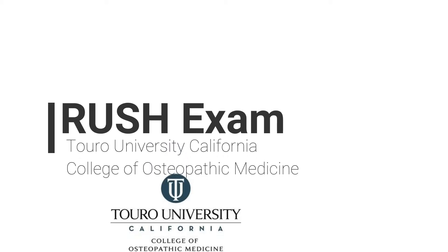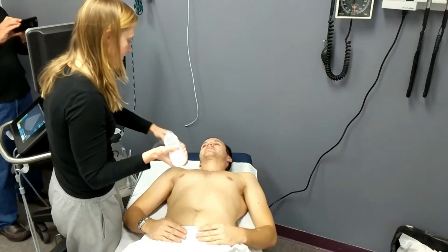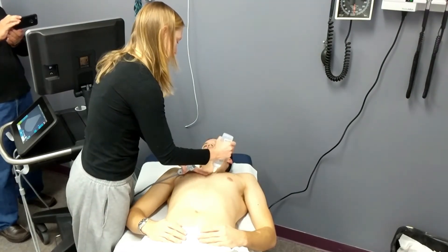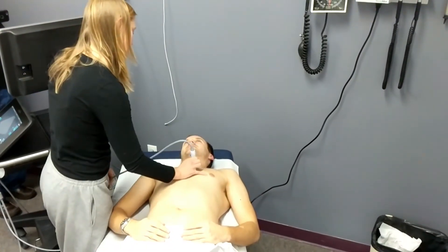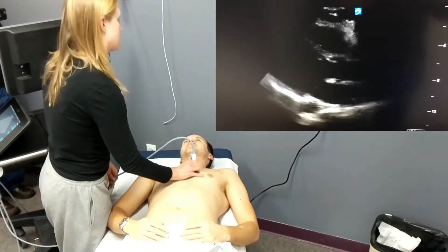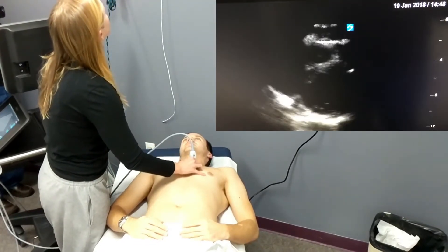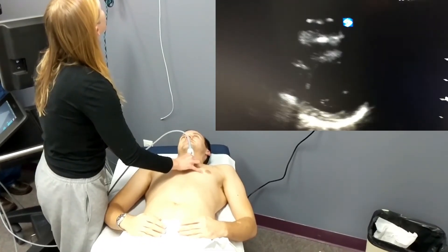The RUSH exam stands for Rapid Ultrasound for Shock and Hypotension. Here we can see our student physician starting with evaluation of the pump. She will examine the heart using the phased array transducer in three different views: the parasternal long axis, which she will rotate to look at the short axis, then the apical four-chamber view, and finally the subxiphoid view.